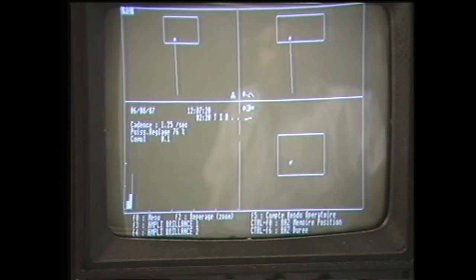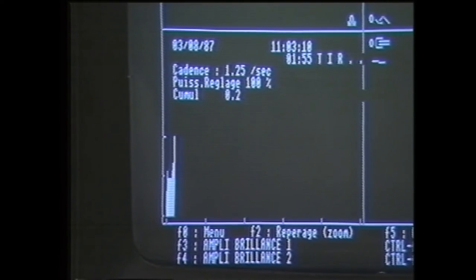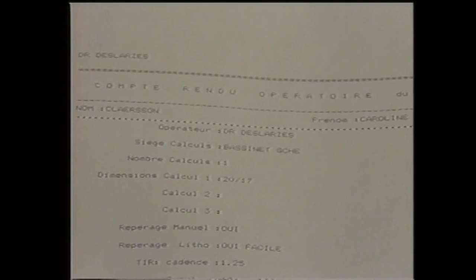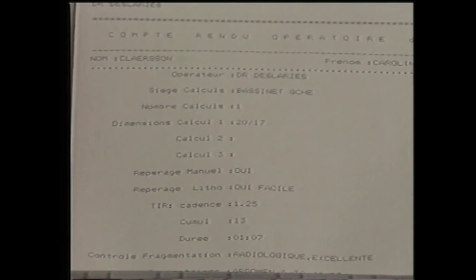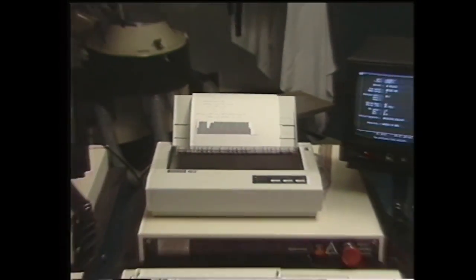Ce tableau nous permet de contrôler durant tout le traitement l'évolution de la situation : le temps de traitement ainsi que la fréquence et l'intensité des ondes de choc. À la fin du traitement, nous obtenons un protocole qui sera versé dans le dossier du patient. Sur cette radiographie faite immédiatement après le traitement, on note la fragmentation du calcul, qui est éliminée quelques jours plus tard.